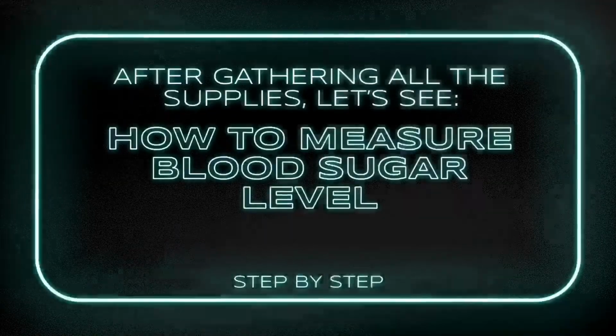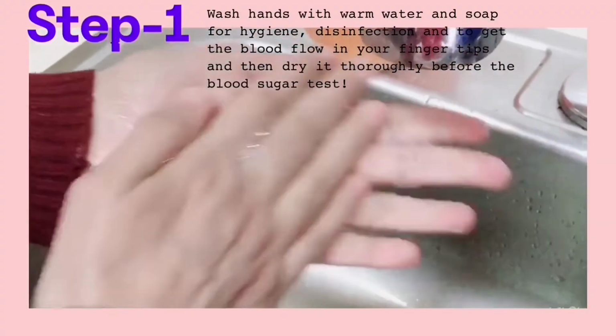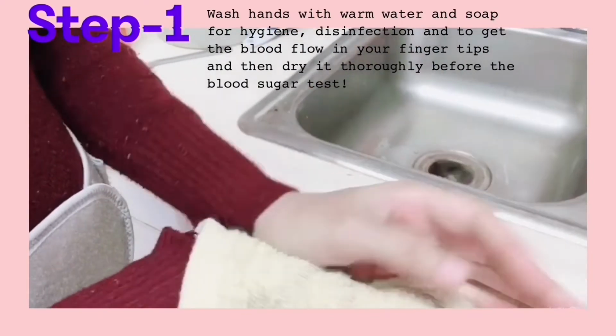Step 1. Wash hands with warm water and soap for hygiene, disinfection, and to get the blood flow in our fingertips, and then dry it thoroughly before we begin the blood sugar test.